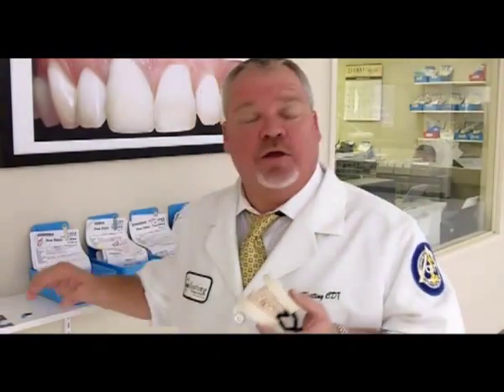On the occlusal of a posterior abutment you need two millimeters. You need at least three-tenths of a millimeter of substructure, two-tenths of opaque — so that's a half millimeter — then another millimeter and a half to try to get some aesthetics. It's very important that you have two millimeters.